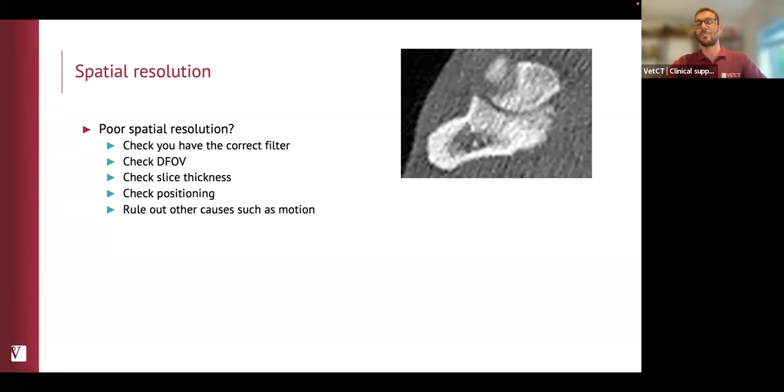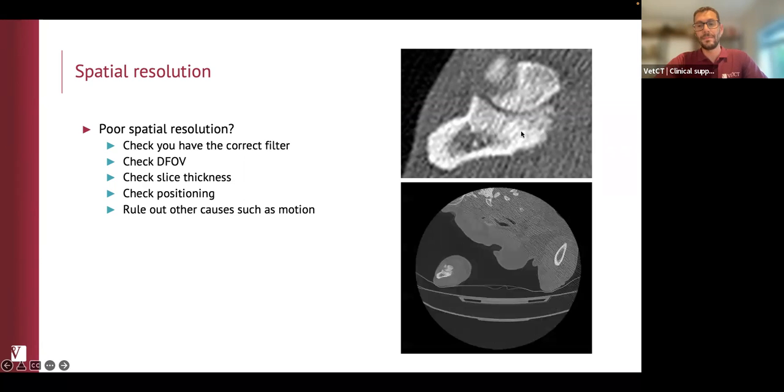So this is unfortunately some of the elbows that we get to read, and you start to see black areas here. Is that a fragment, or could it be a fissure? But see, there's another fissure here that crosses from one bone to the other, so that's not a fissure. And you start to see these fissures going from the bone into the soft tissues, so those are all artifacts. Not only because of the field of view, since they've reconstructed a massive image, so it is going to be impossible to get a diagnostic image of that elbow, but also because there are other factors that are positional, okay?